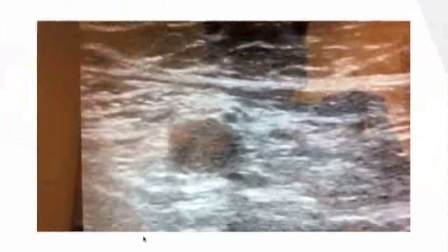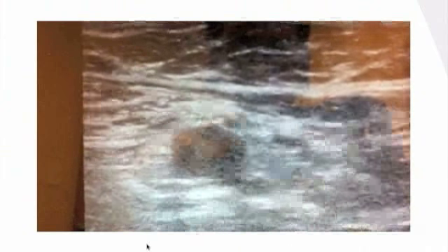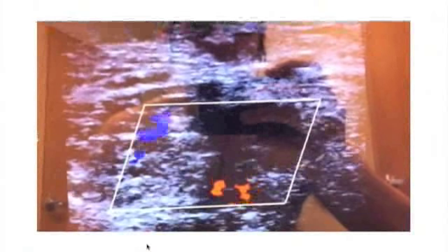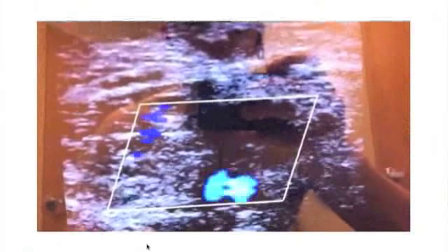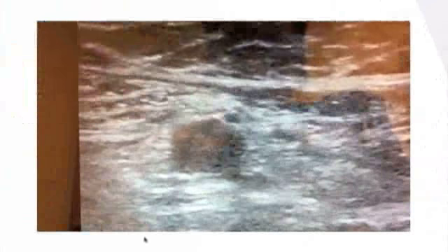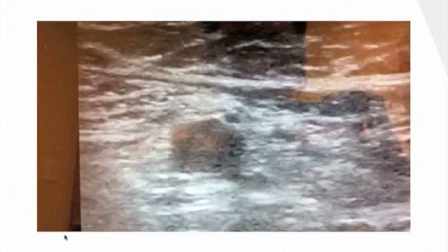Now, is it possible to have no color flow in a vein even though there's not a clot in it? I feel like you're setting me up for something. So it is possible that if the flow is so slow in your vein, that you might not see any pulse, any flow in it. So that's why you can either use augmentation, huh? That's why you can use powered Doppler, right? Remember, a powered Doppler just shows the magnitude of flow rather than velocity, so it's a little bit more sensitive. Or you can augment something, so you can squeeze the calf and cause flow to rush up through the vein quickly. Or you can totally forget about the color and just do the compression like these studies show. So it depends on how much fun you want to have with the ultrasound machine and how many patients you have at that time. But yeah, those are actually two great tips to use if there's some confusion.